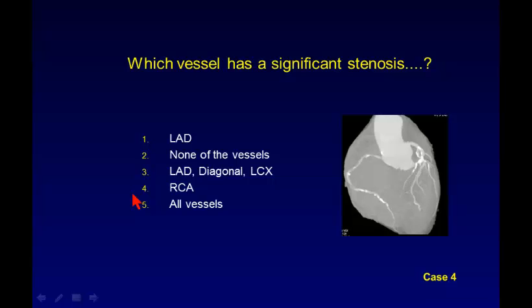There is no non-invasive choice here. Okay, none of the vessels. Oh, that's a very diplomatic approach. That's the non-invasive. That's a good point. The question is, how do you know that the lesions are not producing ischemia? Probably because he's asymptomatic. That's a good point.